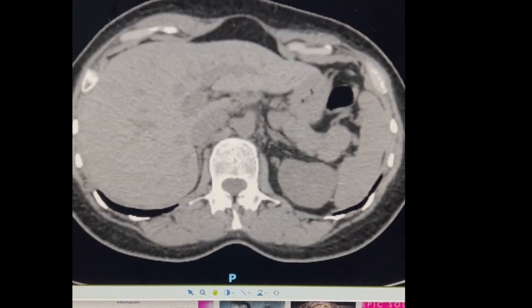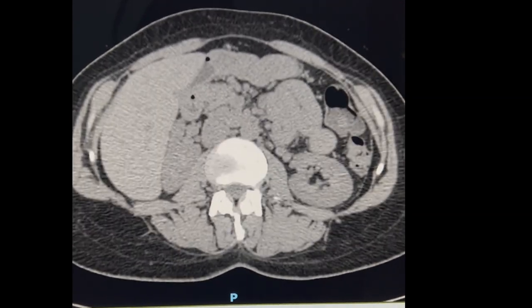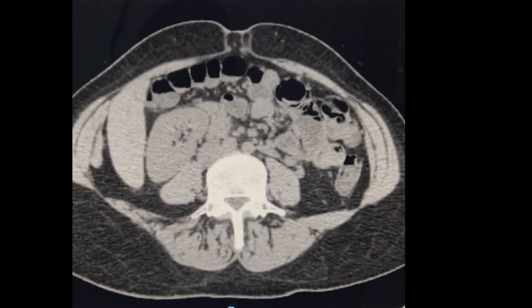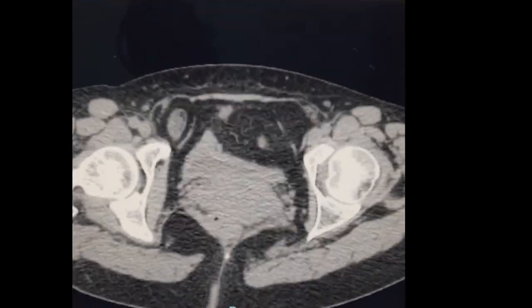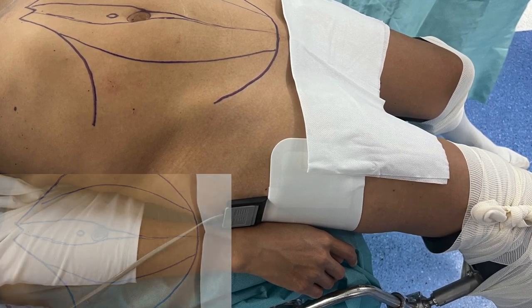This is her CT scan in which we can see diastasis rectus of about 4 centimeters, and a small supraumbilical hernia of about 1 centimeter and an umbilical hernia of about 2 centimeters. This is the position that I use to perform the surgery.